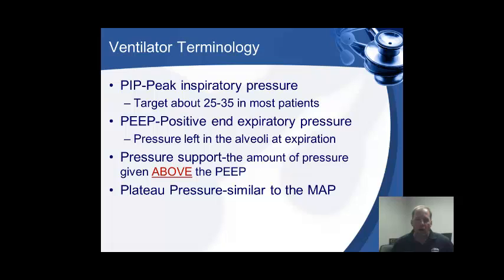It's really hard to open those alveoli up with every breath, and a little bit of PEEP sometimes is a good thing. Our physiologic PEEP is about 3 to 5. So we've got to keep a little bit of that there. As you can imagine, if you blow up a balloon, it's really hard at the beginning, but once you get that initial breath in there, it's a lot easier to blow it up. Alveoli are much like that whenever you're ventilating them.